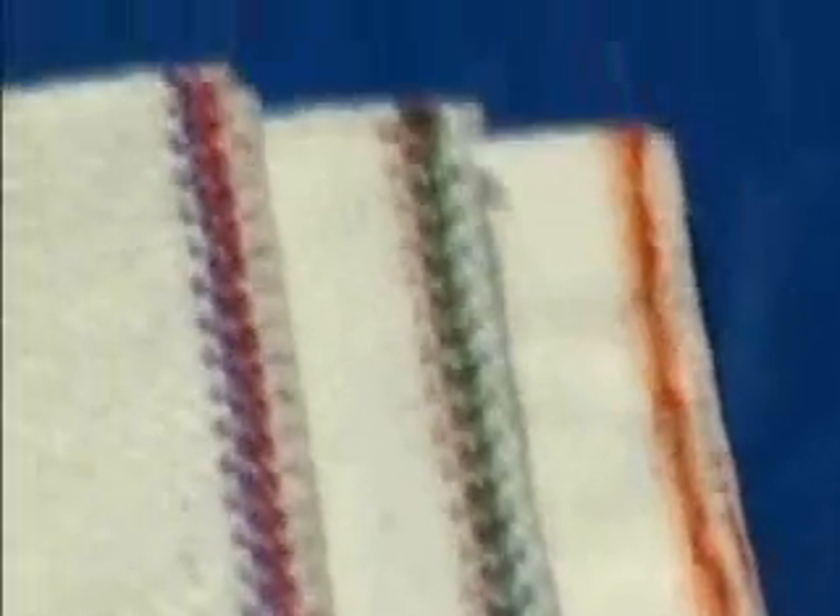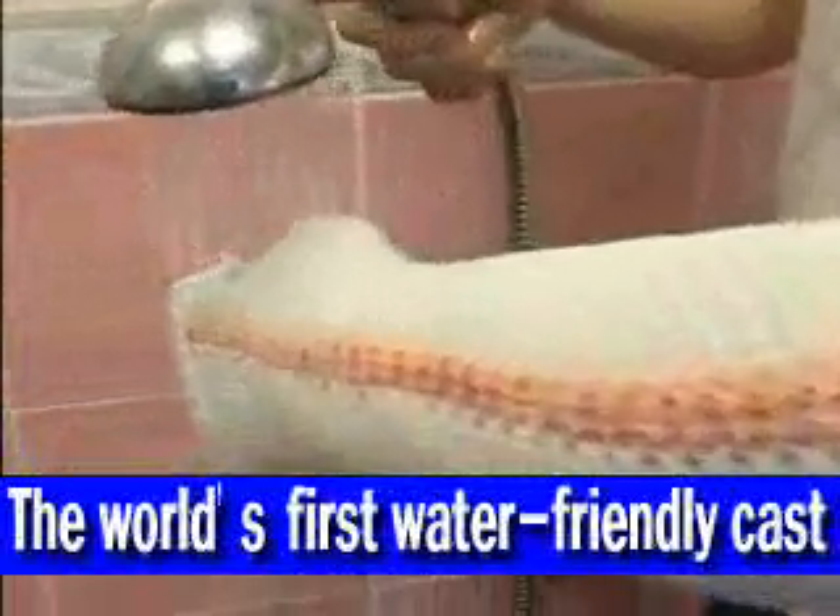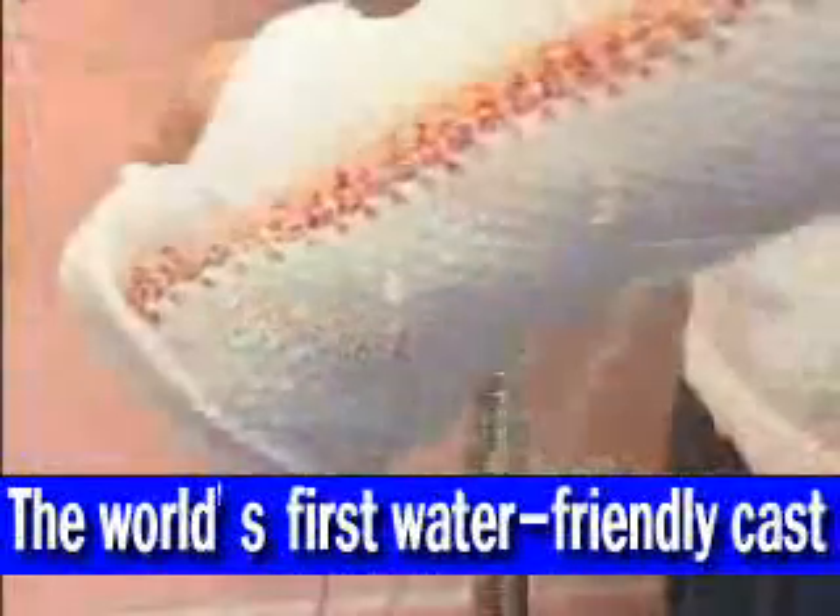The HM cast — the cast of the future — frees us from the limitations and hindrances of the old-fashioned casts of the past. The HM cast allows water to pass through it, enabling patients to wear the cast in any water environment.